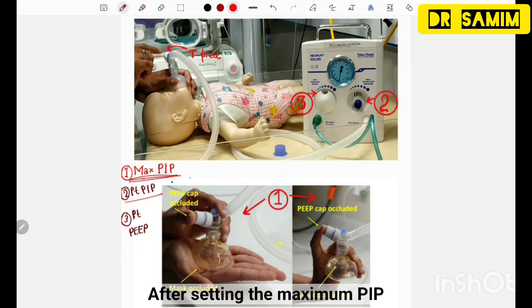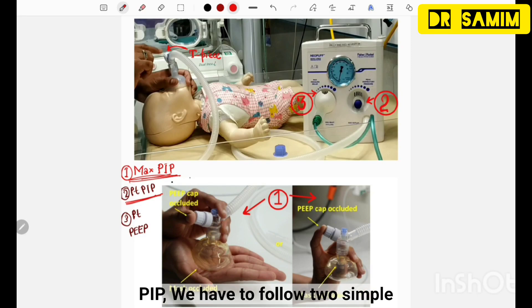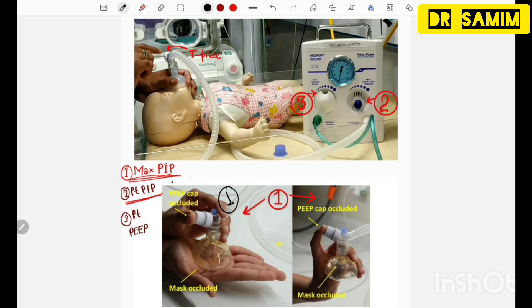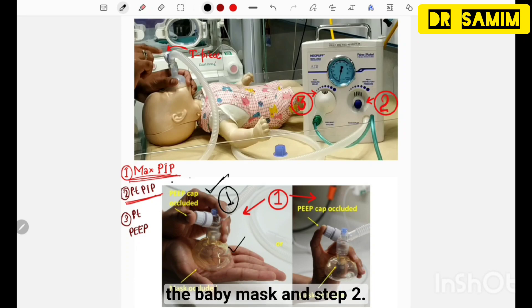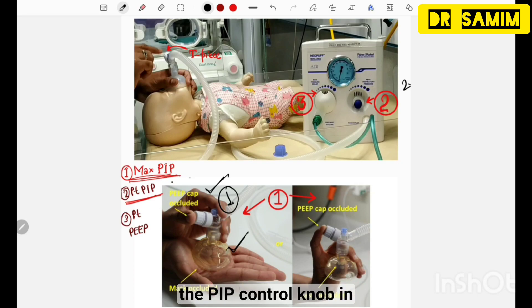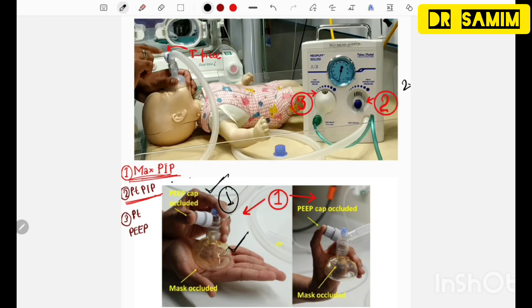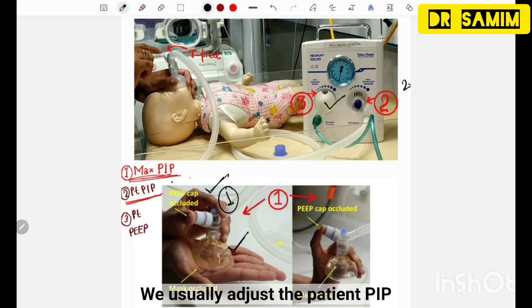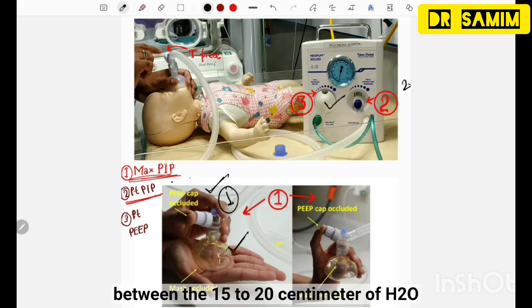After setting the maximum PIP, we now set the patient PIP. To set patient PIP, follow two simple steps. Step 1: occlude the circuit by occluding the PEEP cap and the baby mask. Step 2: rotate the PIP control knob in the anticlockwise direction to adjust the desired PIP. Do not touch the pressure release knob. We usually adjust the patient PIP at 15 cmH2O, or between 15 to 20 cmH2O.